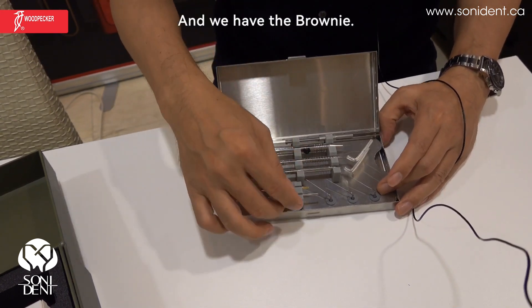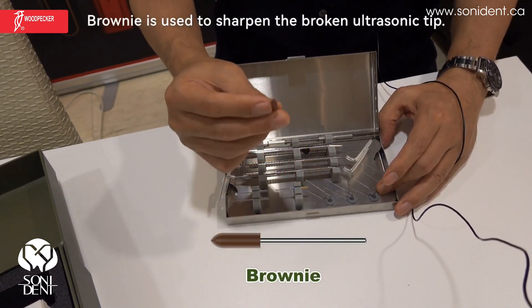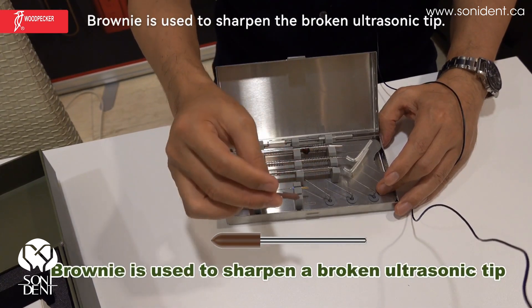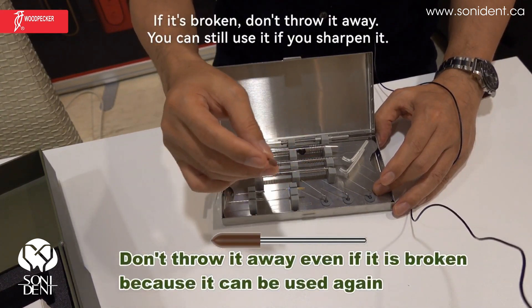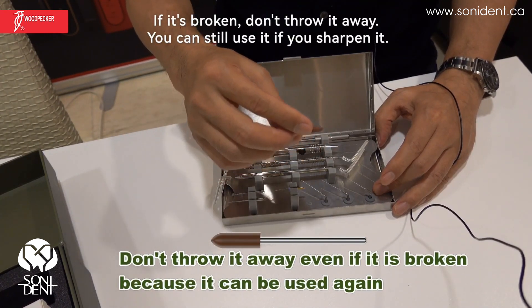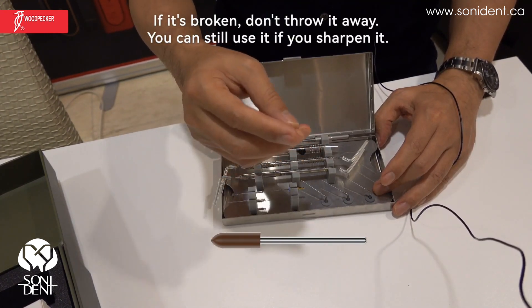And we have the brownie. The brownie is used to sharpen the broken ultrasonic tip. If it's broken, don't throw it away — you can still use it if you sharpen it.